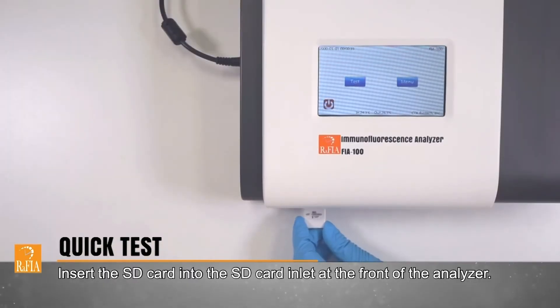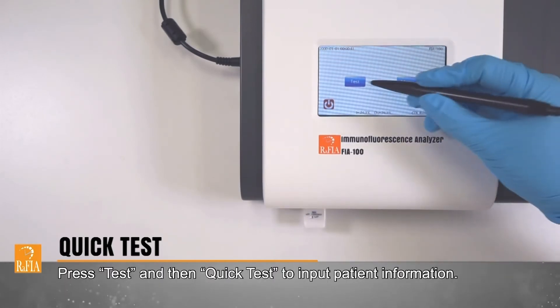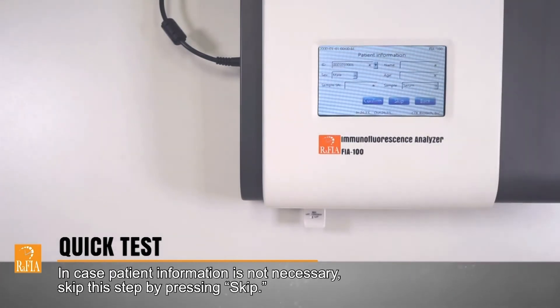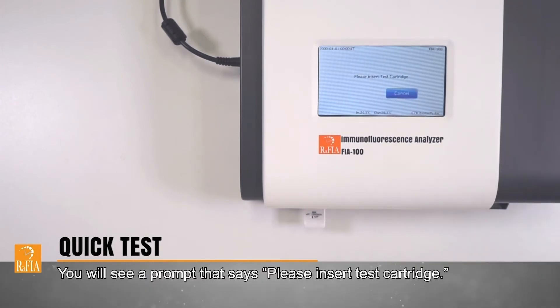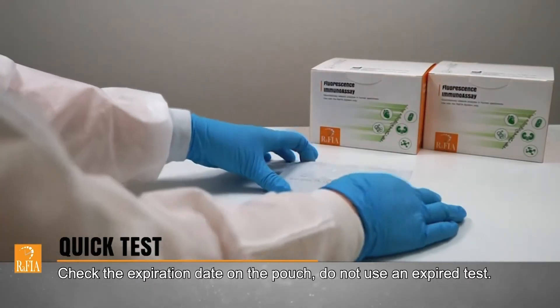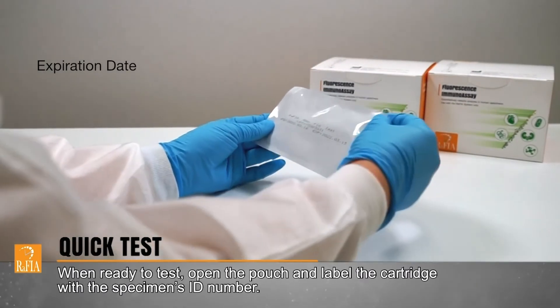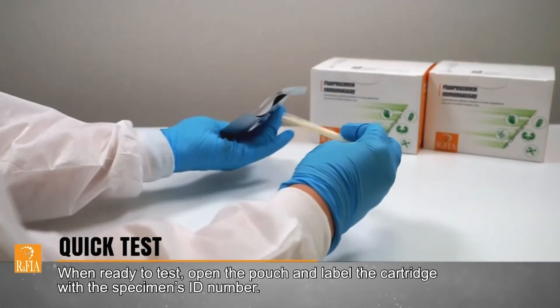Insert the SD card into the SD card inlet at the front of the analyzer. Press Test and then Quick Test to input patient information. In case patient information is not necessary, skip this step by pressing Skip. You will see a prompt that says: please insert test cartridge. Check the expiration date on the pouch. Do not use an expired test. When ready to test, open the pouch and label the cartridge with the specimen's ID number.